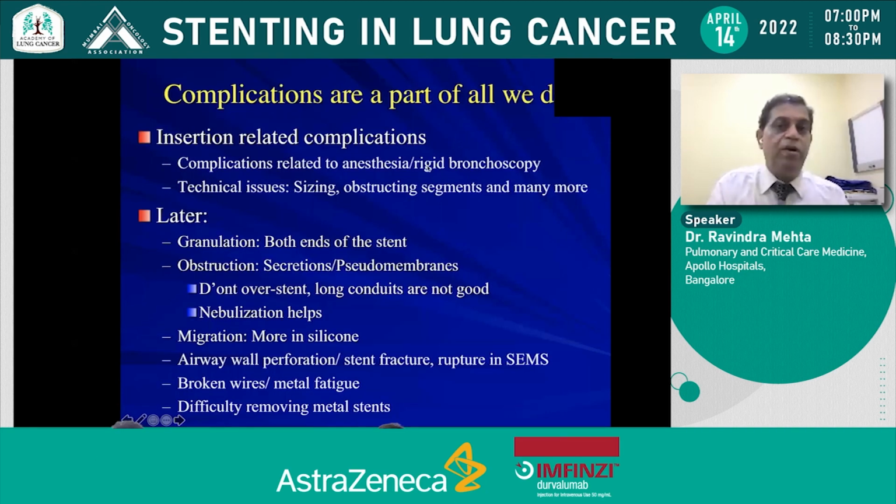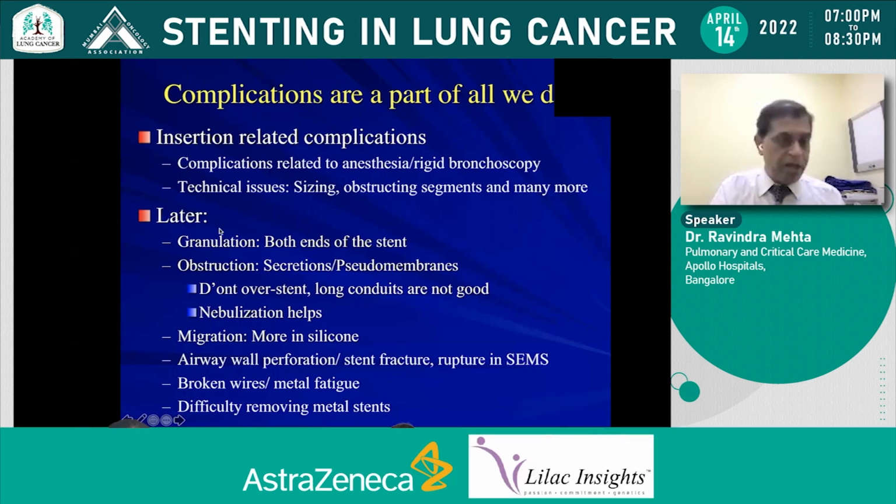Complications, the second part. Complications are part of our lives. It could be, and this is a myriad discussion, but I'll make it brief in the time we have, either insertion-related complications related to anesthesia, rigid bronch, flexible bronch, or technical issues. You haven't sized it correctly, obstructing segments, and so on and so forth. Later, it is not a panacea.